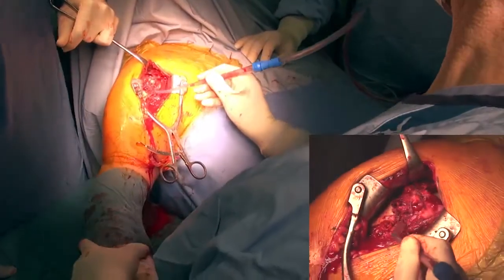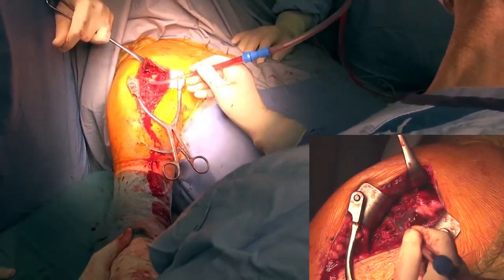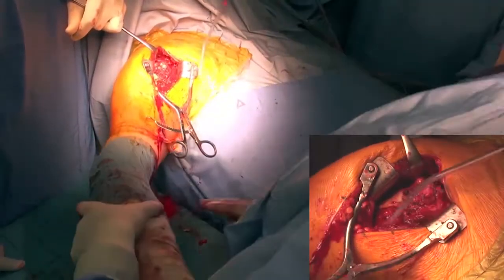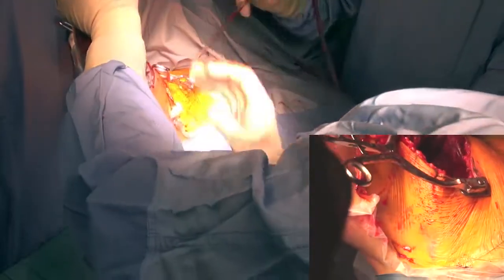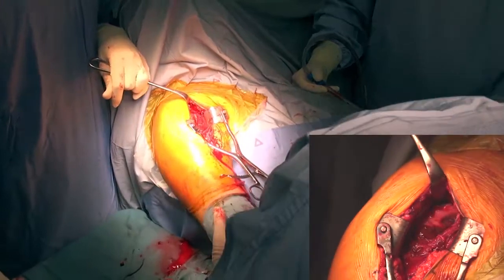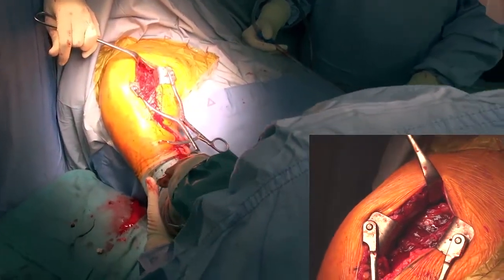Rotation of the arm to check for stability of refixation. There is no movement of the tuberosities against the implant central component. The range of motion is demonstrated. Abduction to 150 degrees, external rotation to 40 degrees.